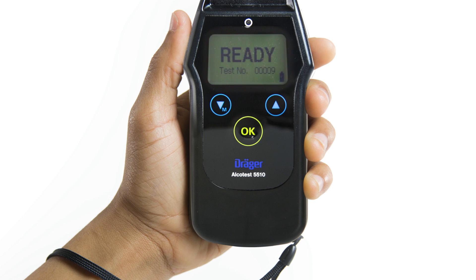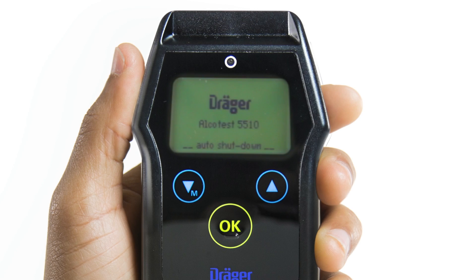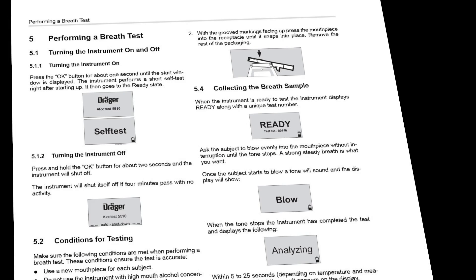To power down the device, press and hold OK until the shutdown screen counts down to one and the device turns off. The device will automatically turn off if not in use for 4 minutes or if the battery voltage is too low. For more information or troubleshooting tips, please refer to the Alkotest 5510 instructions for use, also referred to as the Alkotest 5510 user manual. You can also contact Draeger at 866-385-5900 or visit us online at www.drager.com.